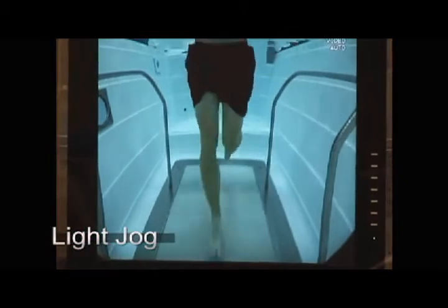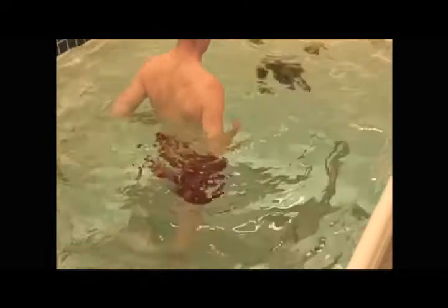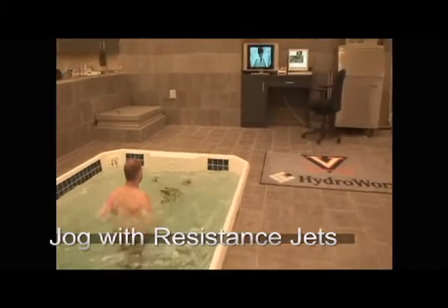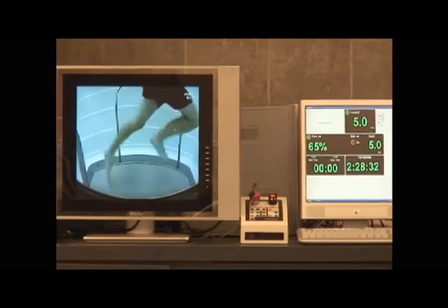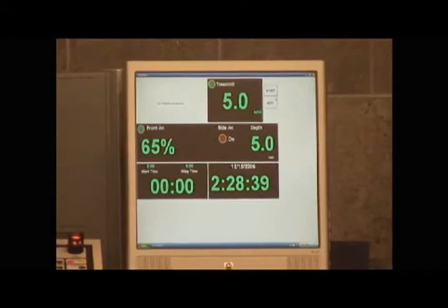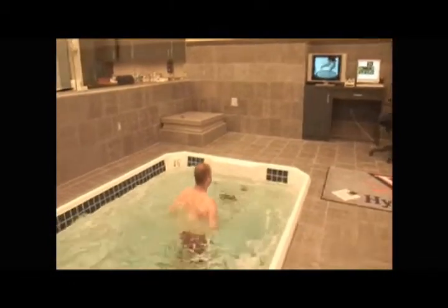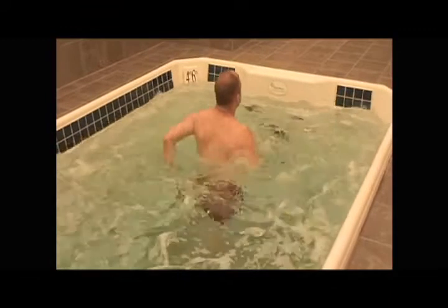Then we bumped him up to five miles an hour. At that point we turned on the resistance jets, starting at 65% resistance, and did that for five minutes. We continued progressing — got him up to six miles an hour, still at 65%, then up to seven miles an hour, and increased the jets to 80%. Then we cooled him down. That was his workout for that day.